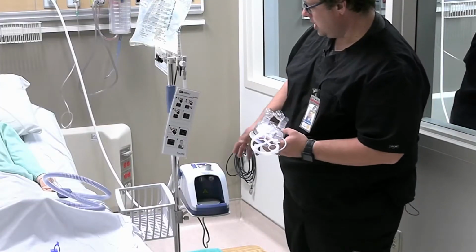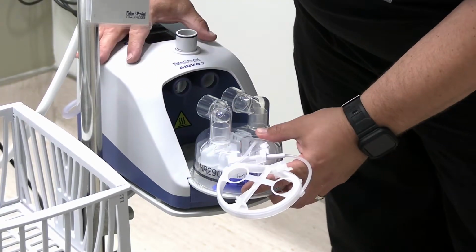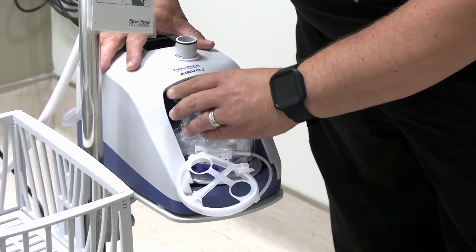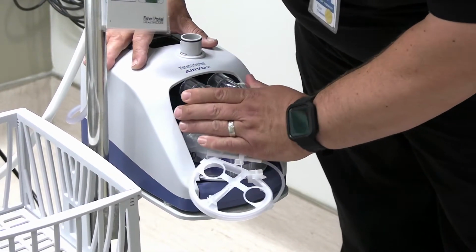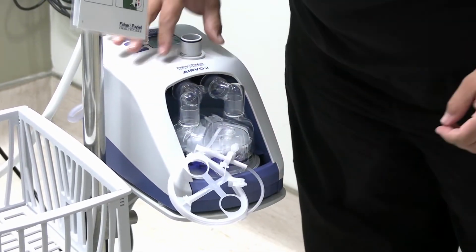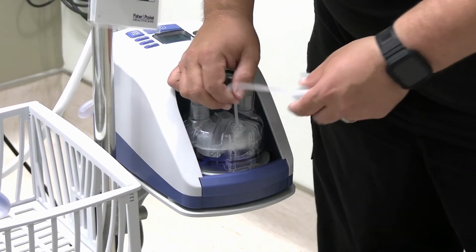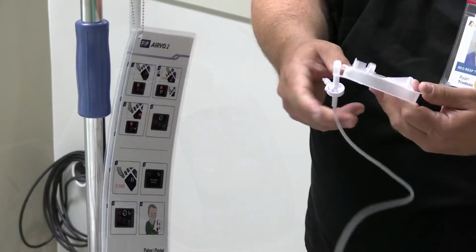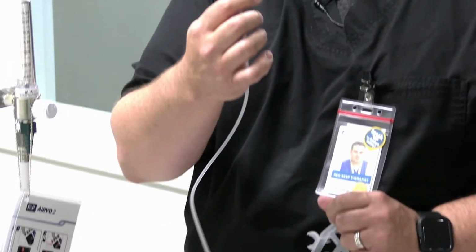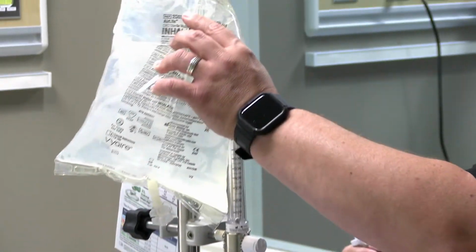We're going to come over to the AIRVO. We are just going to depress this recessed lock here, and we're just going to slide our humidifier chamber into the AIRVO device and connect it to our outlets, just like so. And then you'll hear that click of the device actually locking the humidifier into place. You're then going to grab your fill line and remove it from its coil here. And then just be very careful of the spike here. That is quite sharp when you're going to spike your bag of water.